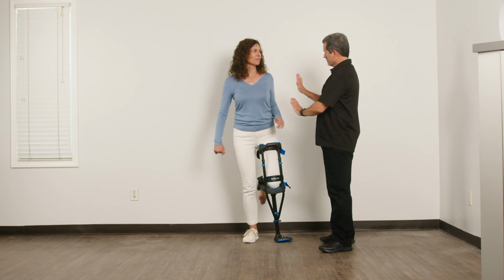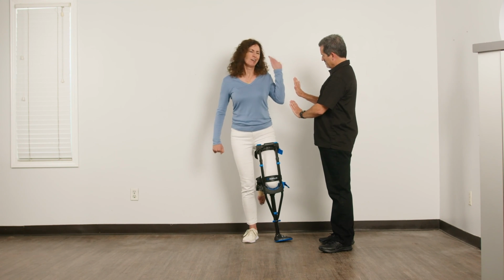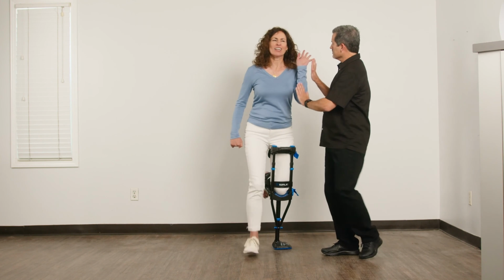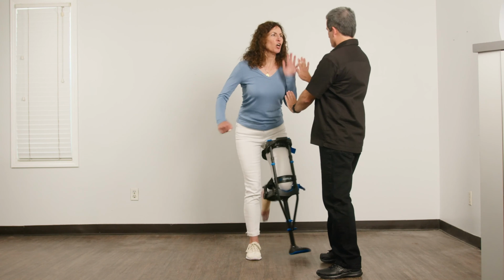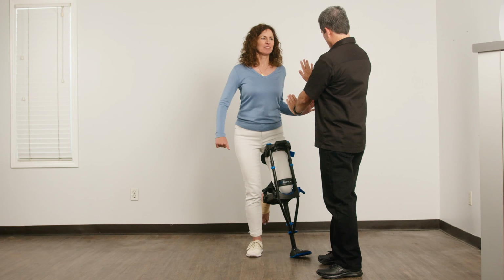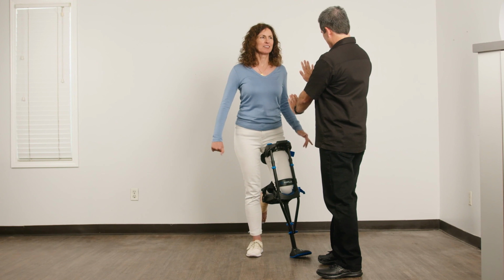Some patients do not want to take instruction or want to shortcut the training process. Don't let them. The fitter must control the training process at all times. You are the teacher, and they are the student. This relationship must be enforced to ensure their safety and success.